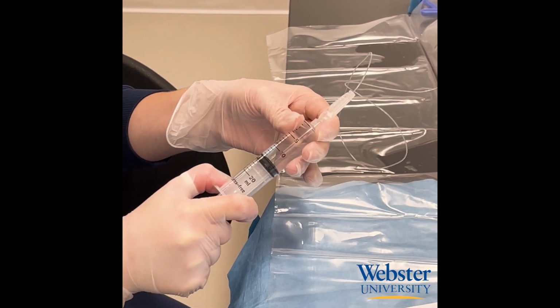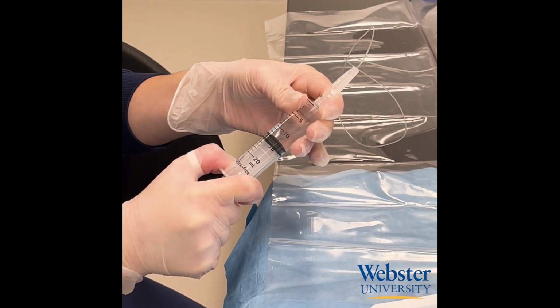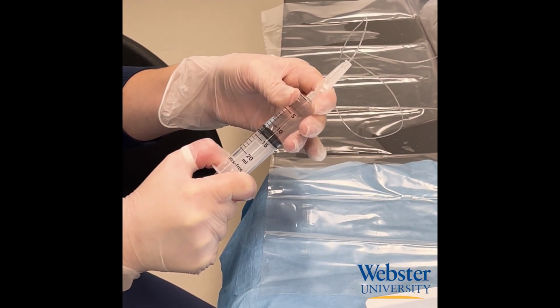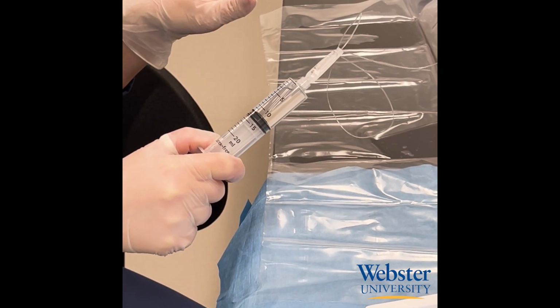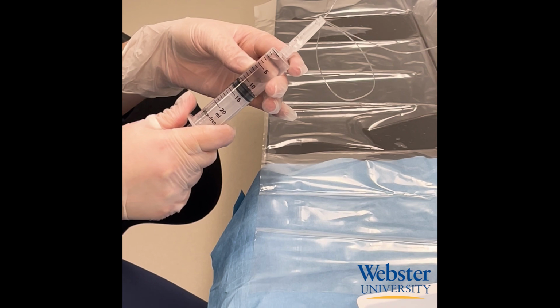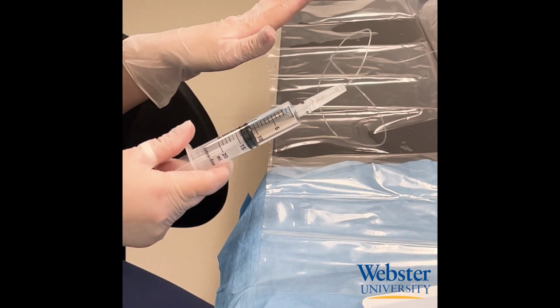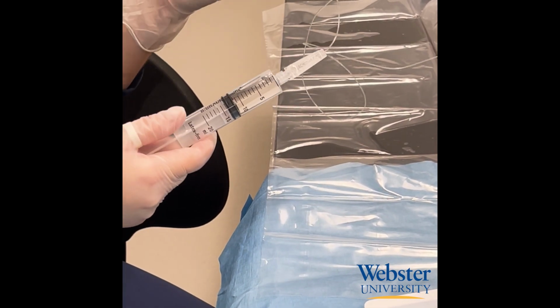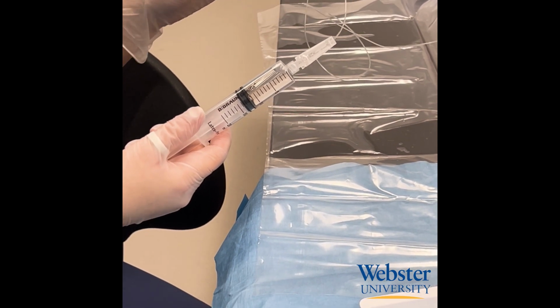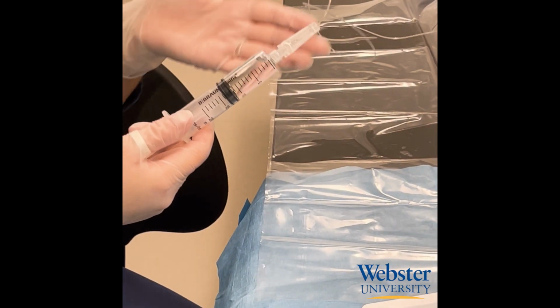The total bolus dose is often dependent on the height, age, and position of the patient. So after 10 milliliters have been injected, the injection should be paused for 3 minutes to assess the height of the block. If it hasn't reached the desired level, then an additional 5 mL can be bolused at a time until the desired block is reached.